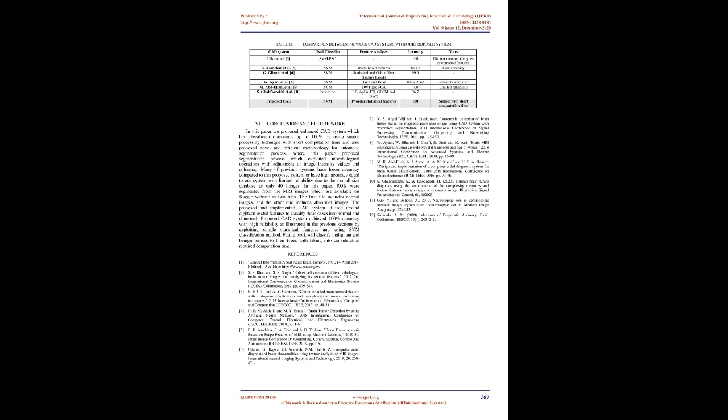Performance measures. There are a lot of metrics used to assess the performance of a CAD system, and each metric measures a specific perspective 12. The most famous one is the accuracy, and its mathematical expression is as in Eq. 2, where TP is true positive, TN is true negative, FP is false positive, and FN is false negative. Another important metric is sensitivity, which is defined as the ability to identify the presence of the disease, and it can be calculated using Eq. 3.